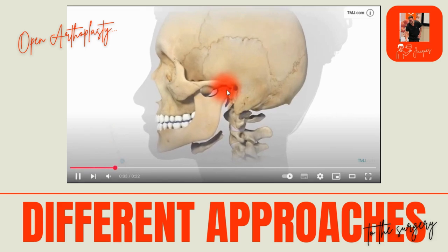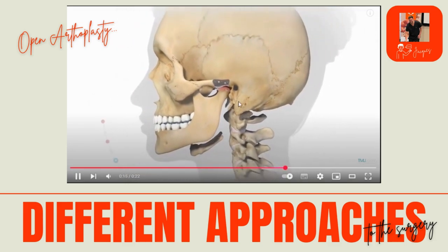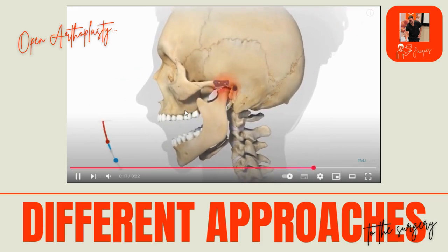In this area you can see there are issues with the articulation at the TMJ. They place the spacer with the prosthesis, and it allows for better articulation on these 2 joint surfaces.